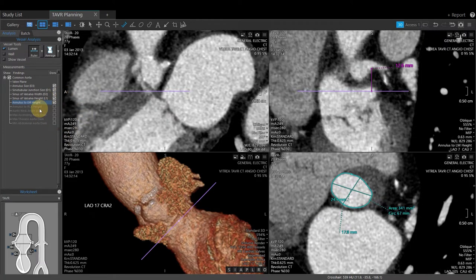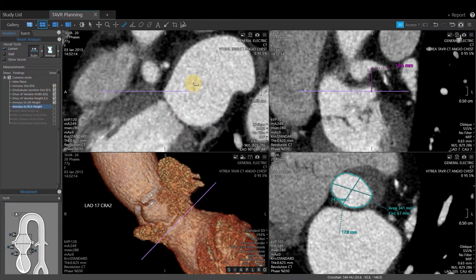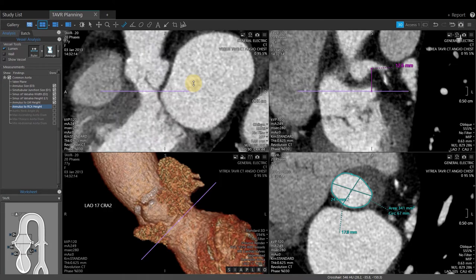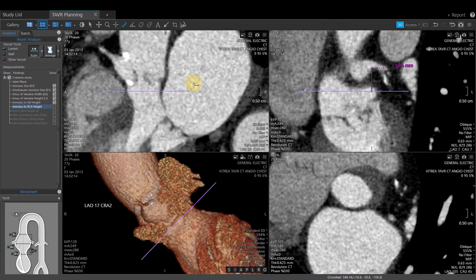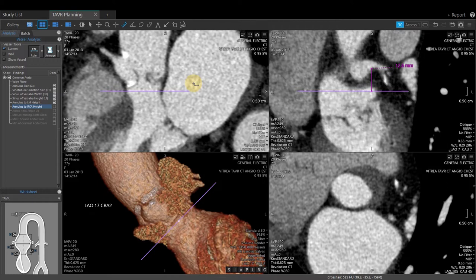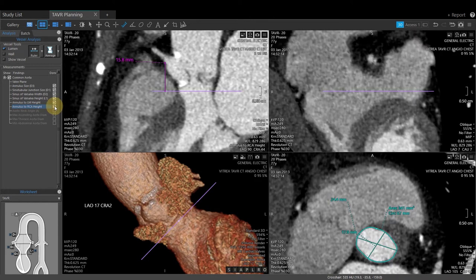The next measurement is the annulus to RCA height. Left-click to activate, then roll the center wheel to navigate to the RCA. Once the ostia of the RCA is visualized, left-click, which will drop the ruler tool straight down to the valve plane. Click Done to lock this measurement in, then take a snapshot to save.